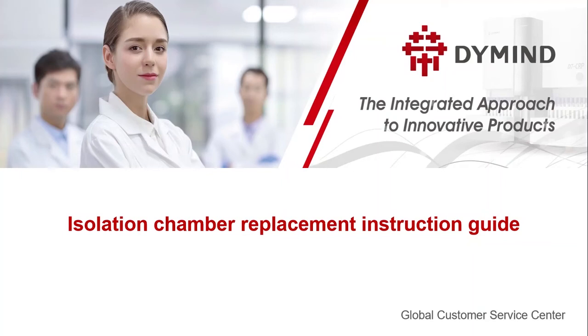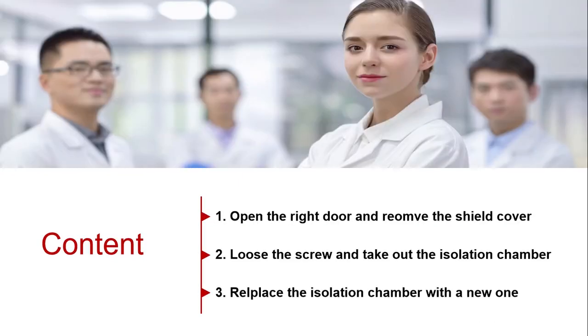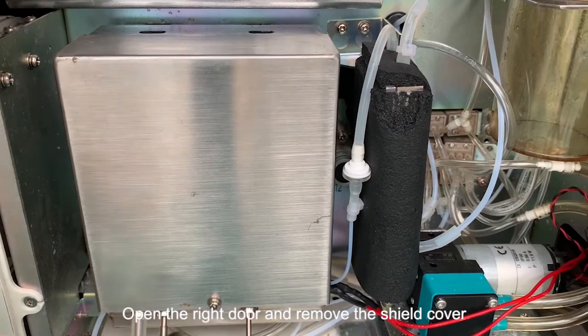Here we introduce how to replace the WBC and RBC isolation chamber. Open the right door and remove the shield cover.